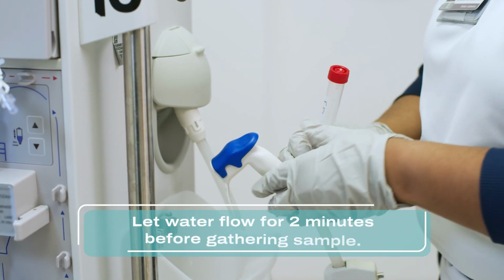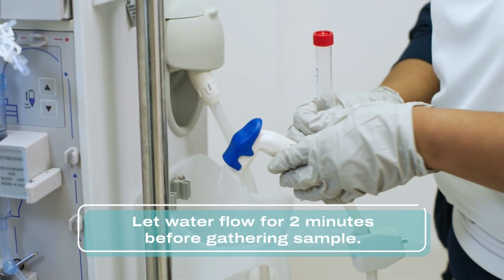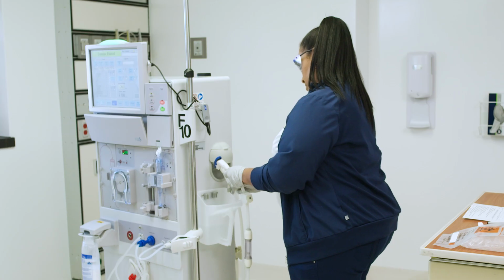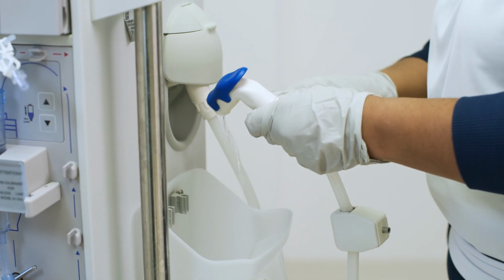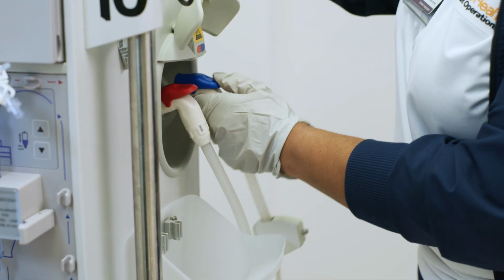Turn on the water and let it flow for 2 minutes. Then, using the clean catch method, fill the tube with water. When the tube is full, replace the cap and turn off the flow of water. Reattach the line and turn off the machine.